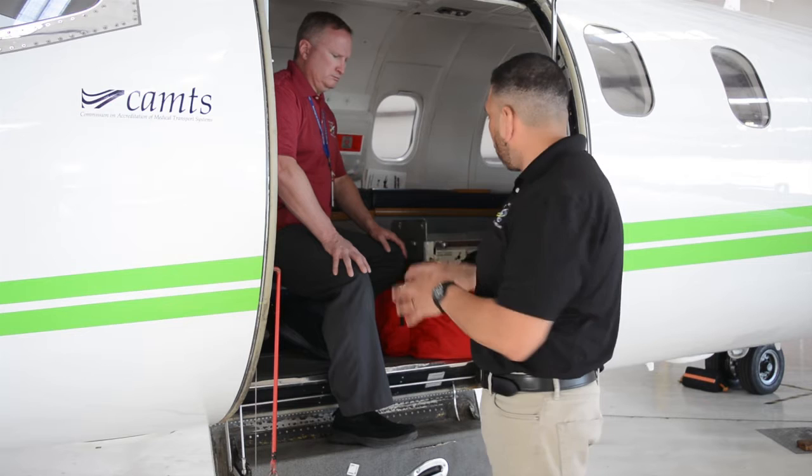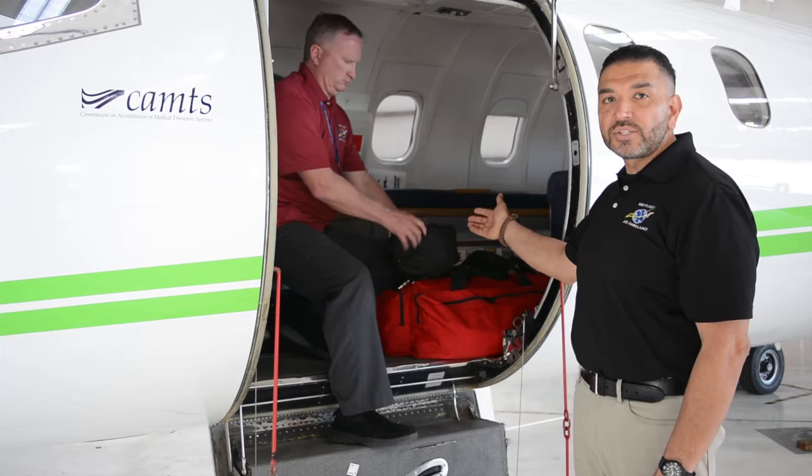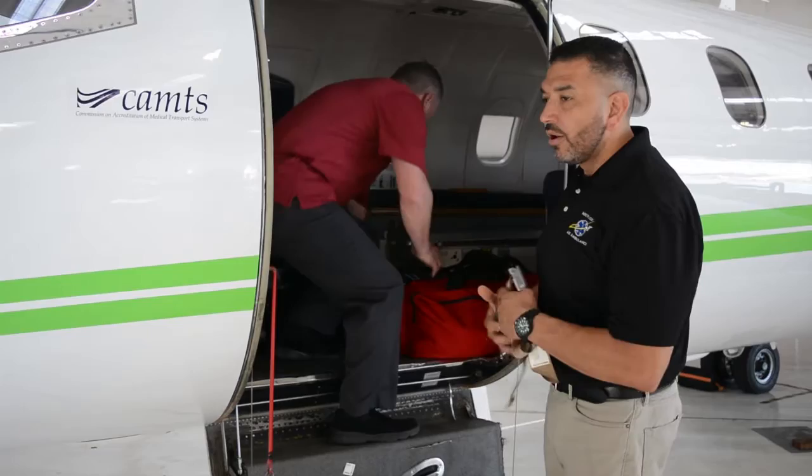So one option that we have is under the seat, in one of the black bags, we have cargo netting that is located with the seatbelt extenders. We have two seatbelt extenders in one of the black bags, and we also have cargo netting. So just zooming in on this seat, you could see that we've set up the cargo netting on the seat here.